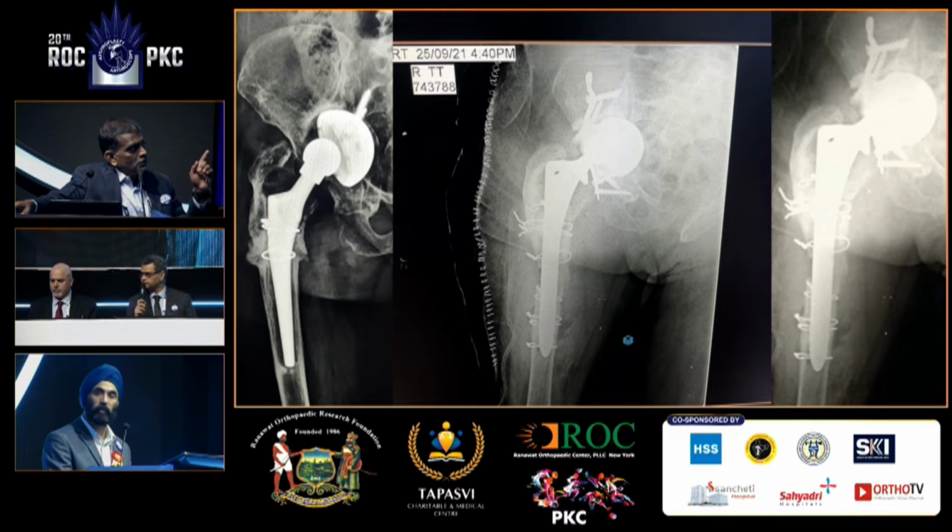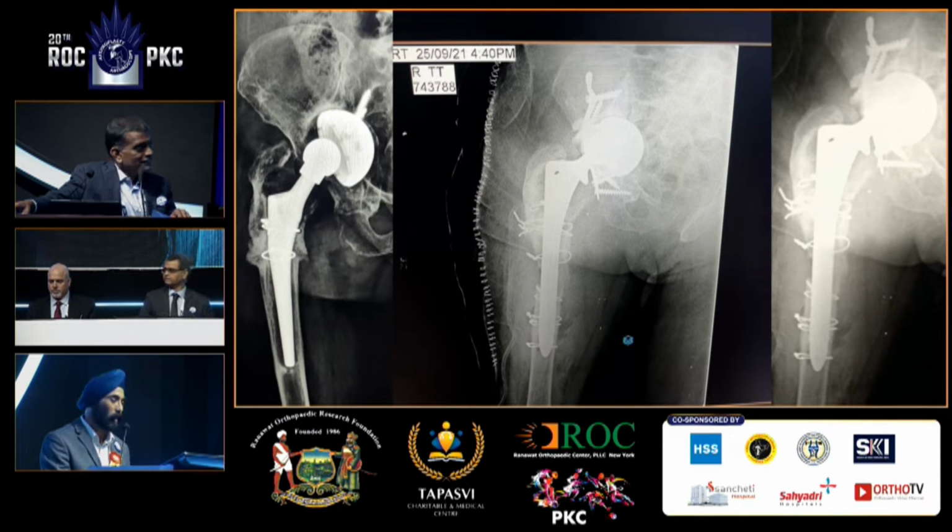That works very well. Are there any screws in your cup, IPS? I don't see any screws in your cup. No, no screws. You just put the cup like that and impact it in. My only question is, where did you get that cage, or did you cut the cage? He cut the cage. You cut the cage actually.